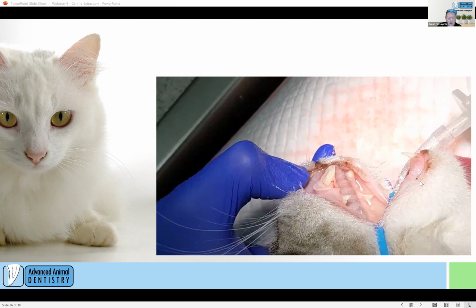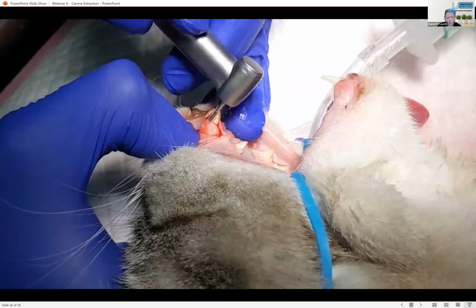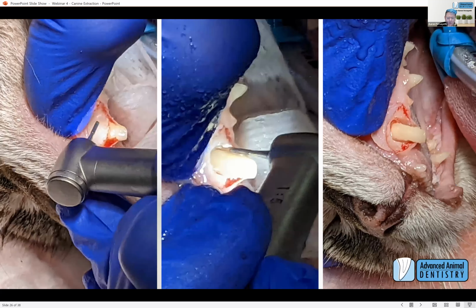And no one's asked the question, but a common question that comes up, of course, if you're doing dentistry and you have an uncuffed tube, is what about all this fluid? I think we've got to be cognizant at all times with all of our patients of where all this fluid is going. And we still continue to work laterally, and we tend to tip heads down as much as we can. So the fluid just runs out the front. It shouldn't pool, and it shouldn't go down the trachea. And we're always just constantly mindful of it, I think. Hopefully we are very switched on to that and mindful of what's going on.